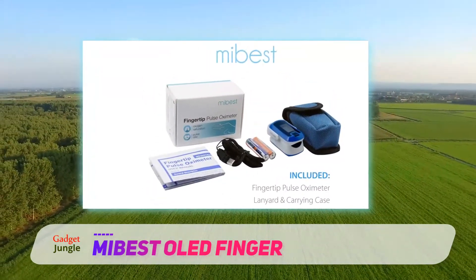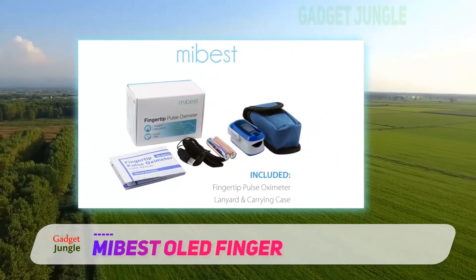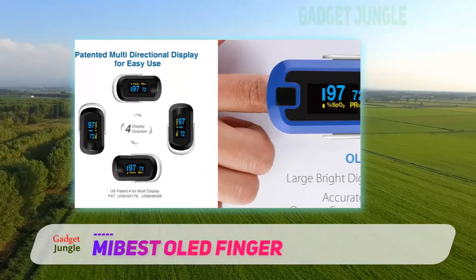While it is not FDA approved for medical use, it is accurate enough to be used by sportsmen and aviators. It's awesome for mountain climbers, trainers, athletes, and even pilots.